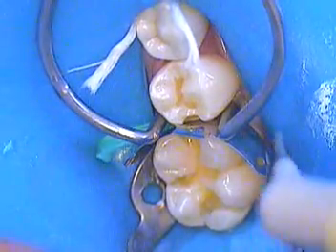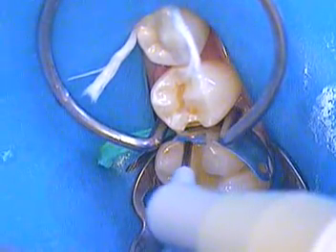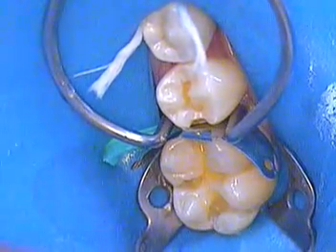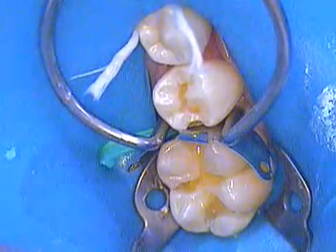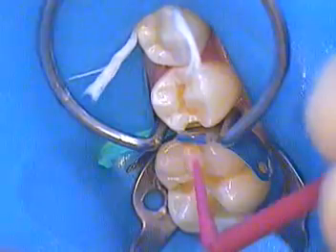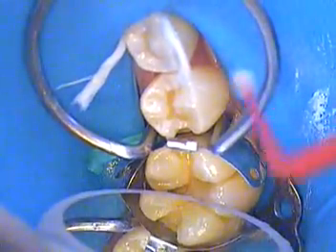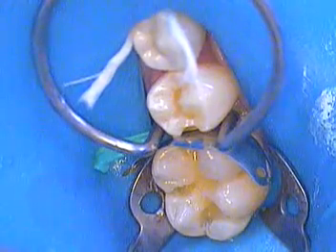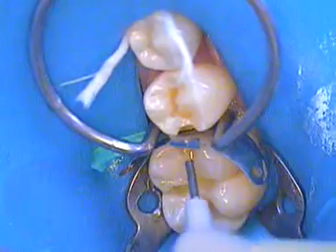We're going to go ahead and add our base layer now, which is flowable — posterior flowable. We'll put that in place. I'm just going to build up this mesial box first, get that in there. I'm going to wipe away a little bit of the excess and put in our first layer of composite.